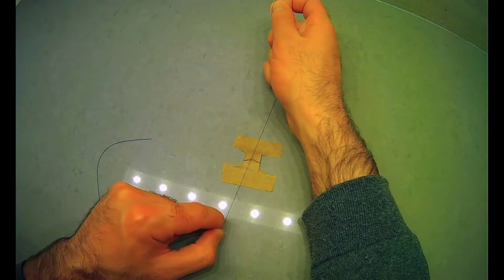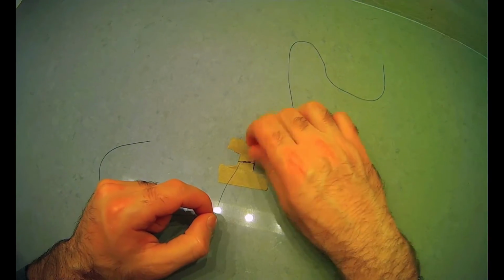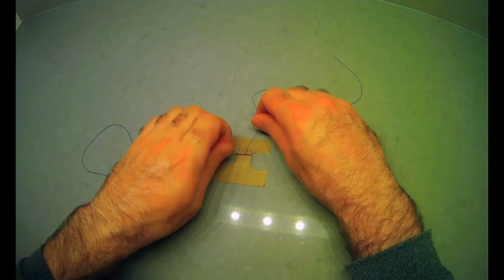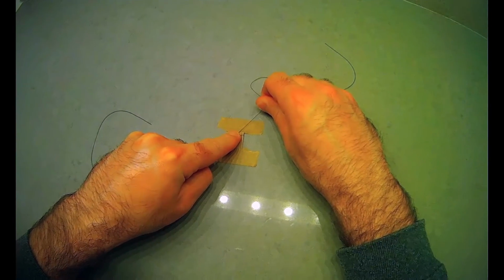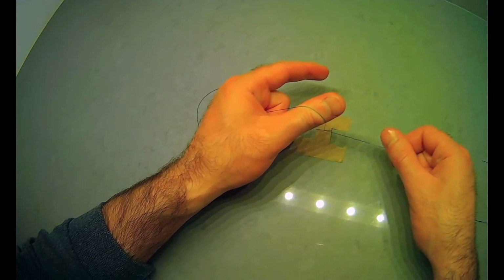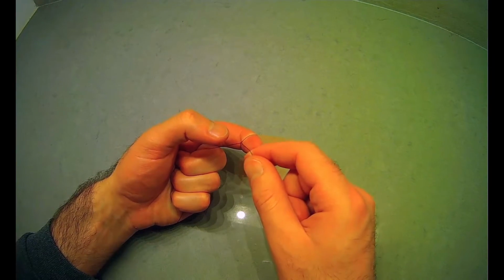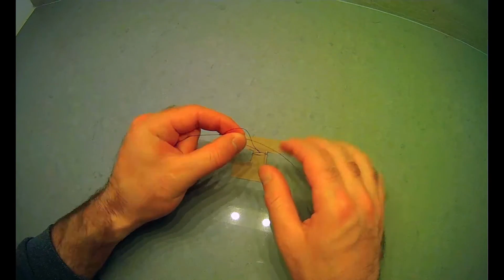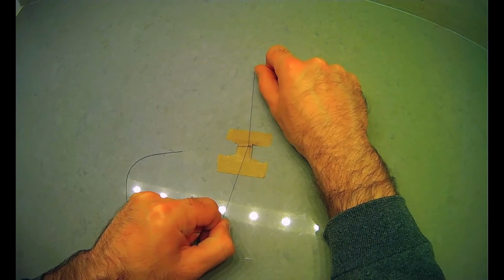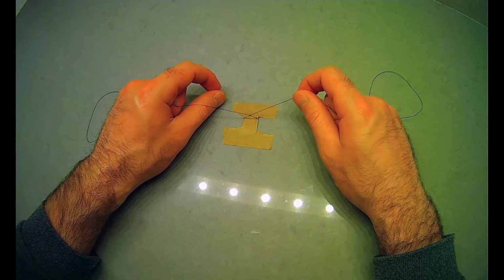It's a little hard to show with something that's so small here, but if you do this with a shoelace, you would see that if you twist in this orientation, the knot will be a little bit more flat. And then also, you can place your finger down just to make sure that it's nice and tight. So we'll do that one more time. Over our thumb like this, come around from the other side, pinch, go through, place the suture on your index finger, and then pull it back to the other side. And as you pull, rotate your hands as such to make sure that the knot falls into place. So this is the first example of our two-handed knot here.